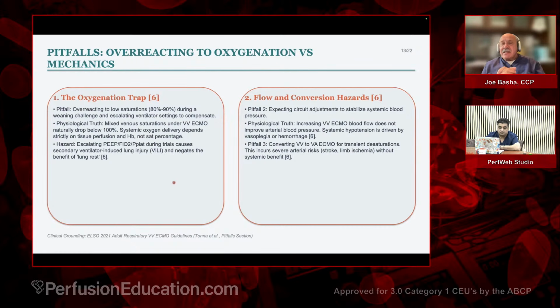Pitfalls: overreacting to oxygenation versus mechanics. The oxygenation trap is overreacting to low saturations, 80 to 90%, during a weaning challenge, and escalating ventilatory settings to compensate. Sometimes you have to be patient and wait and not overreact. Things happen, but then they correct themselves. So the patient won't die short term with an 80 to 90% saturation. So just think about it for a minute.